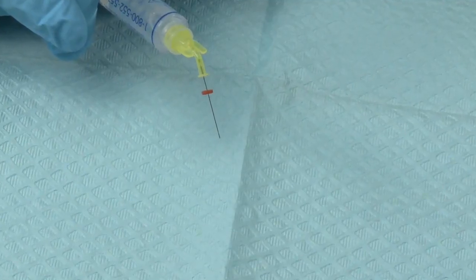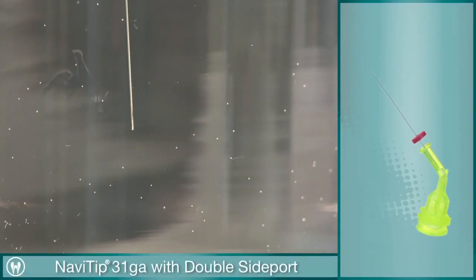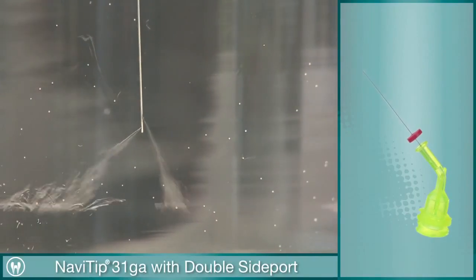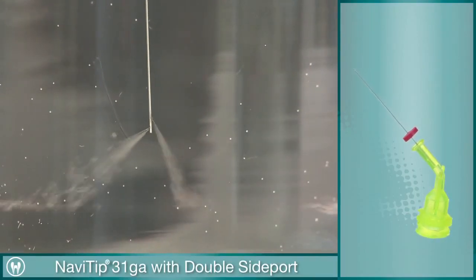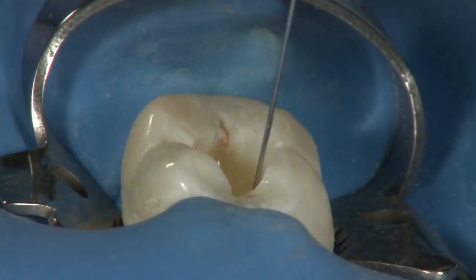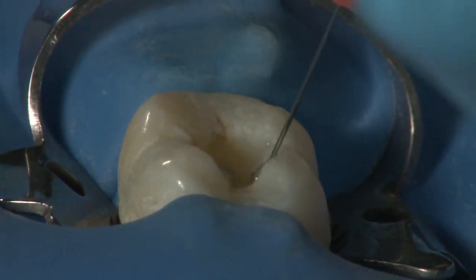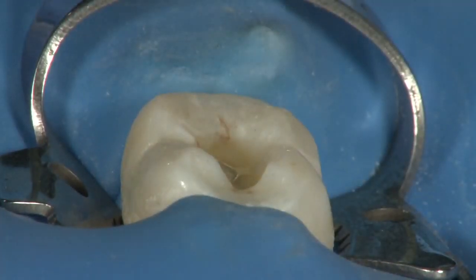This tip's small size allows for delivery into intricate canal spaces, while the closed end and double side ports minimize the risk of expressing the sodium hypochlorite beyond the apex. Begin irrigation by completely filling the canal with Chloracid, being cautious not to express any irrigant beyond the apex.